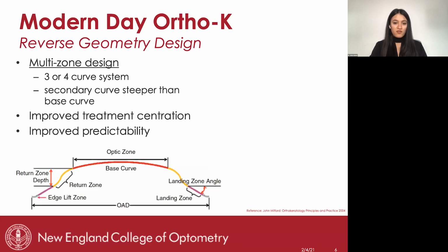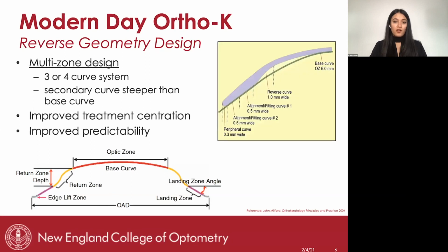So most of the time we're looking at about 3 to 4 different curves, and the curves vary. Some of the 4 curve designs have a separate alignment or fitting curve over here that can be manipulated as well to achieve a better fit or better centration.